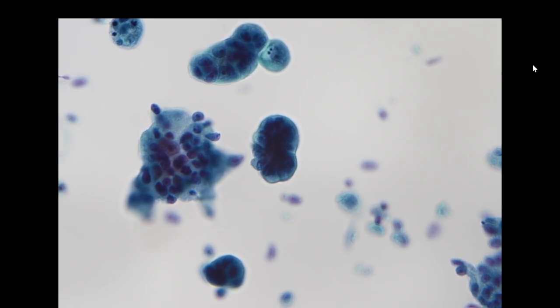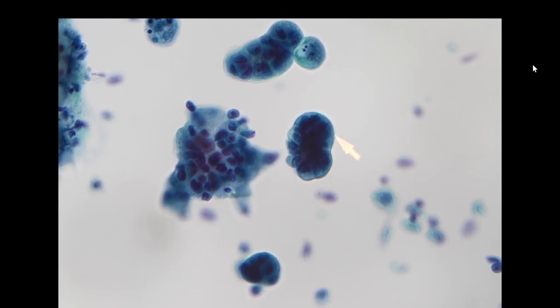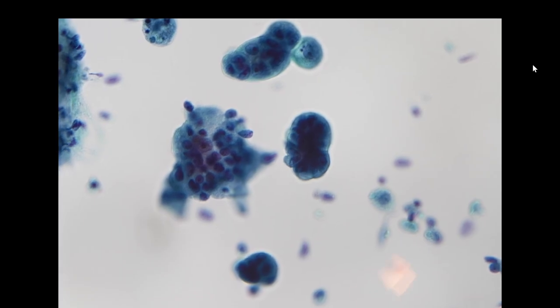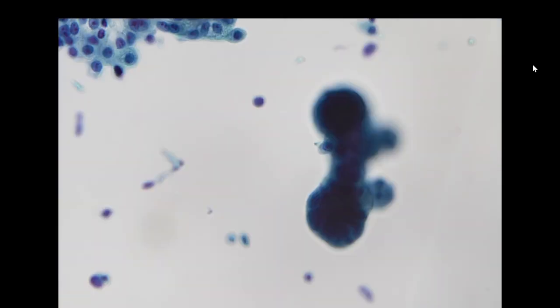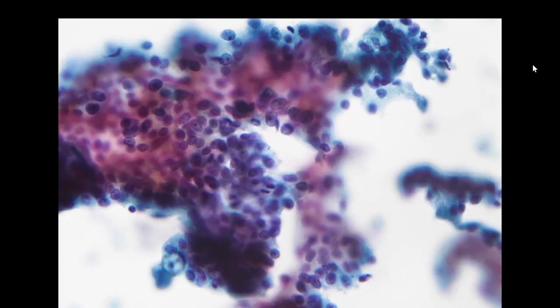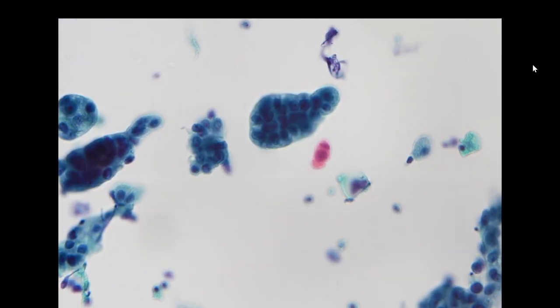So in this specimen, we do see adenocarcinoma because we have a classic glandular arrangement, even a little bit of goblet cell feature. And here we do see nuclear atypia and prominent nucleoli. So this is compatible with adenocarcinoma. Because of this location, and she doesn't have any history, this is coming from an ENT outpatient clinic. So she doesn't know anything about where the lesion is at all.